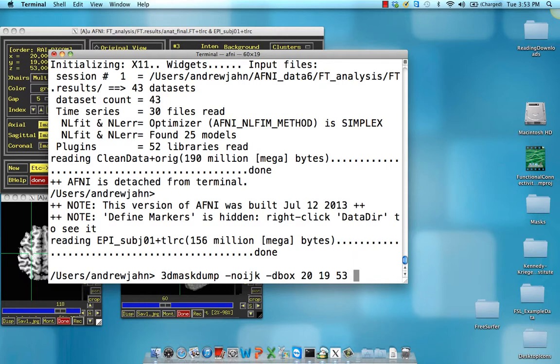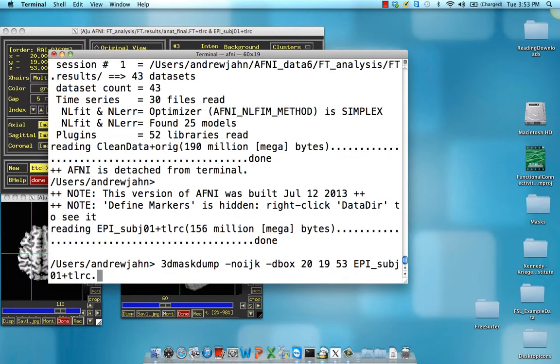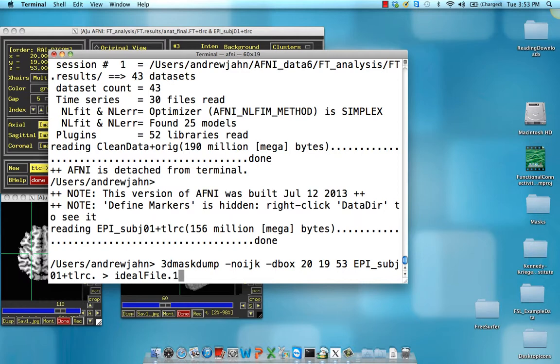And we are going to give it this, let's see here, epi subject 01 as an input. And we're going to redirect it to an ideal file, idealfile.1d.